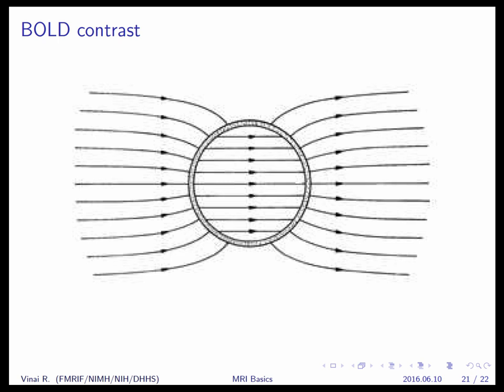So what will happen is on a microscopic scale, when you excite an image, because this is a slightly higher field, the protons precessing here will precess at a slightly higher frequency than the protons precessing out here further away in the tissue. So it means they lose coherence faster. So think of this as a single voxel, because this is a few microns. Okay, so this is tiny. But if you have things within your voxel that are losing coherence so quickly, the net signal that you have coming out is smaller. So remember from the T2 precession diagram, as things lost coherence with each other, the net vector that we could see and measure became smaller.